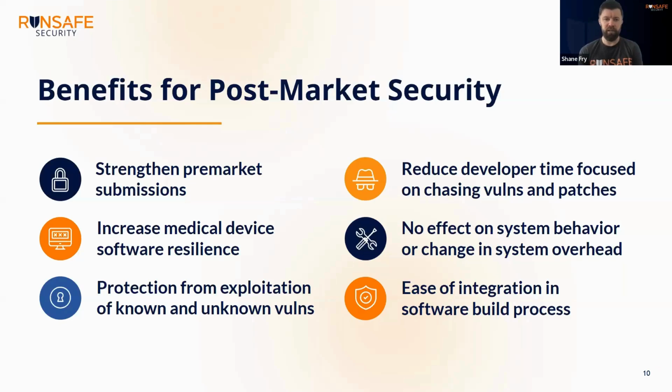And then for the customer side of things, the provider side, really lean on your device manufacturers to provide you those SBOMs. There was a good talk at S4 last year, which is an ICS OT conference. So it's not healthcare specific, but I think a lot of it applies. A lot of folks were talking about how hard it was to get SBOMs out of their vendors. So, if you can add SBOM delivery as part of your contractual delivery requirements for purchase, I think that's definitely worth doing. Get those SBOMs, push your vendors to actually ship you secure software. So that would be my three takeaways.